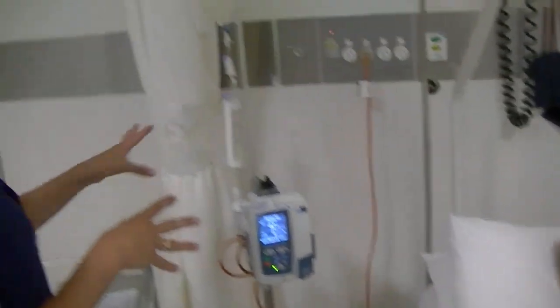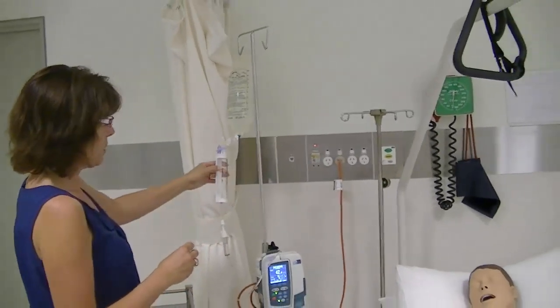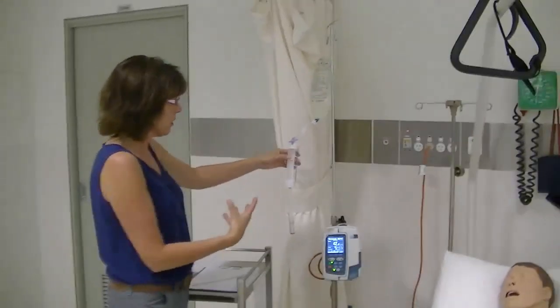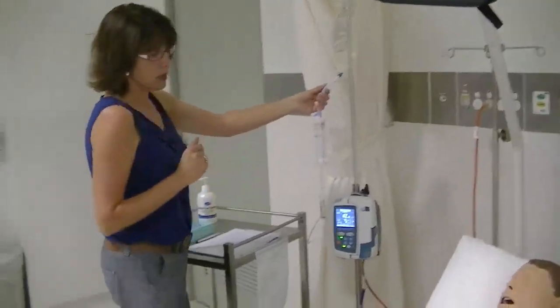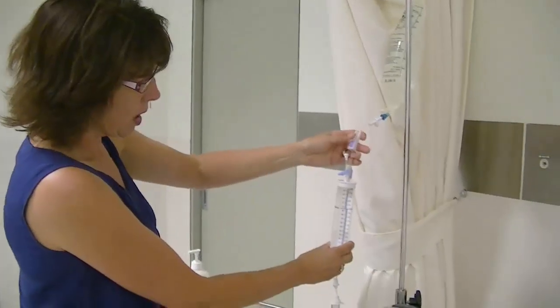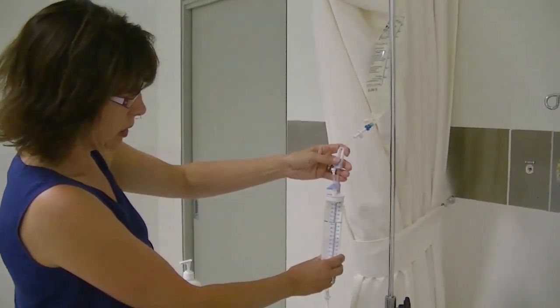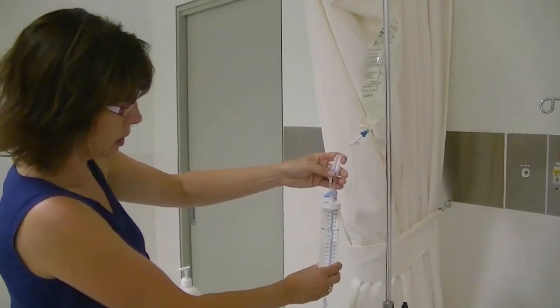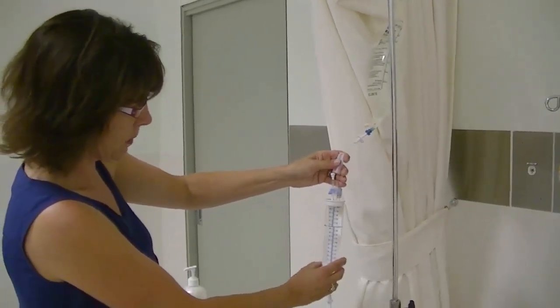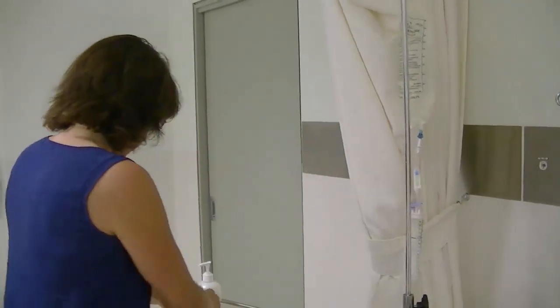Because I'm putting a concentrated drug into the burette, I need to put more fluid into the burette first so that the drug becomes dilute. It said fill to a desired volume. 50 to 100 mils is desirable. Okay, so I've put, what's got 70 mils in it so far.